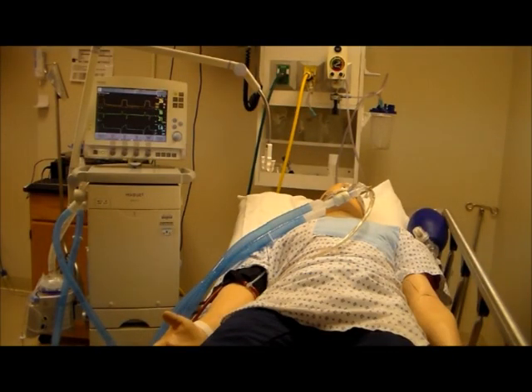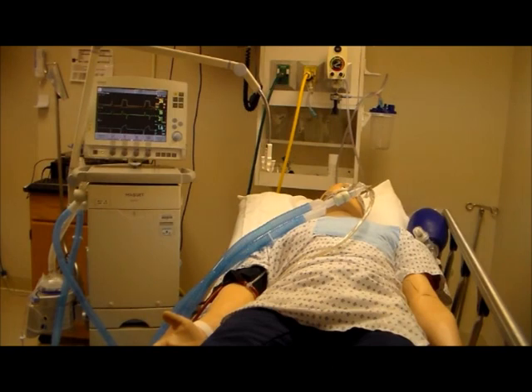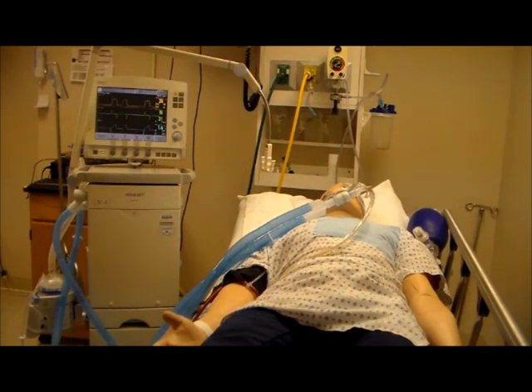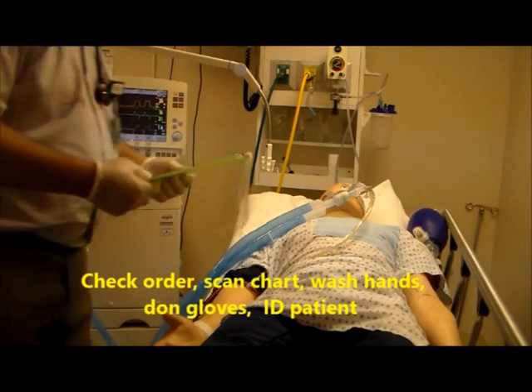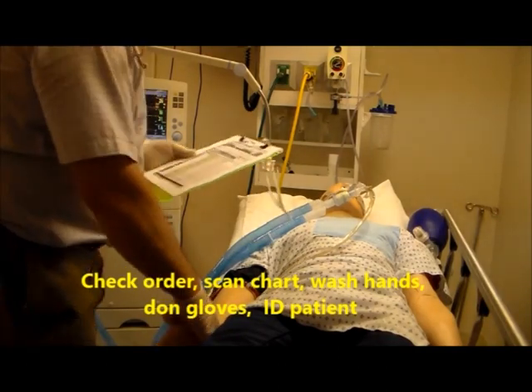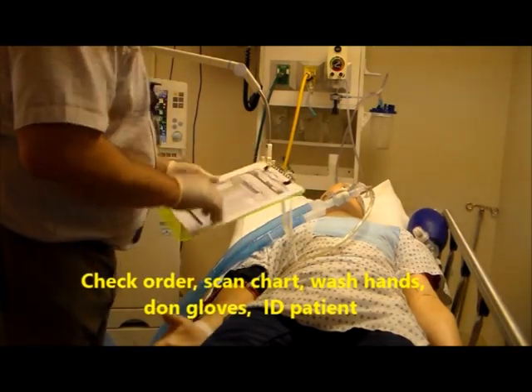Today we're going to be going through setting up an inline nebulizer through the Servo-i. The first things you want to do are check your order, check your chart for history, and identify your patient.